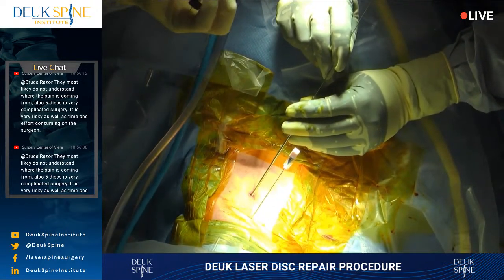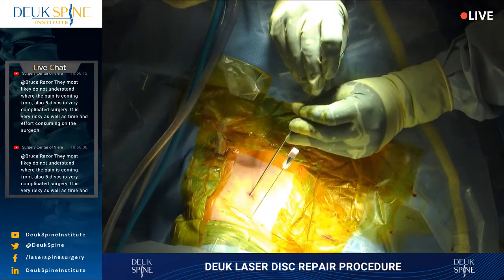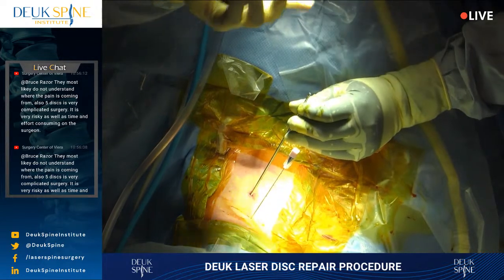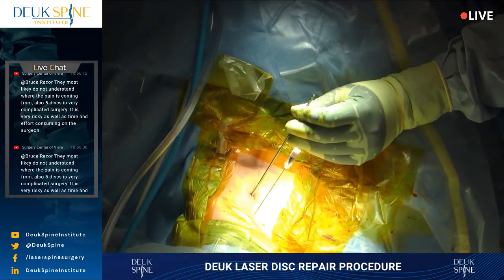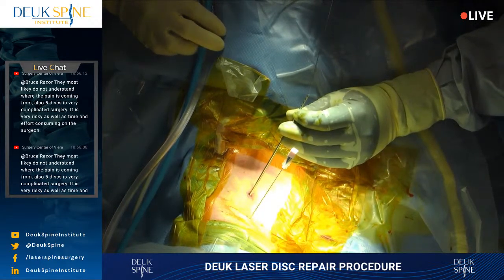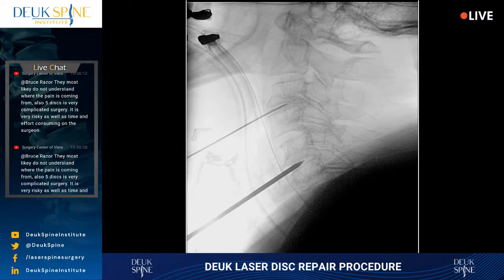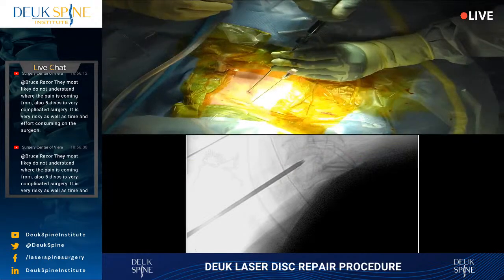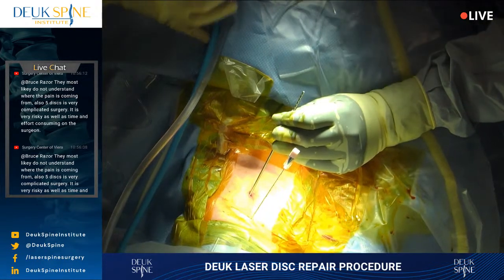Shot. Now, we haven't gotten into this disc, right? This is the first time. Shot. Just need to clean out the pipe. We'll do our discogram. We're going to shoot the discogram right now. And I'm injecting really 3 things. A little bit of saline, a little omnipaque, and a little indigo carmine. Doesn't want to come out. Shot. Shot. No, still clogged.